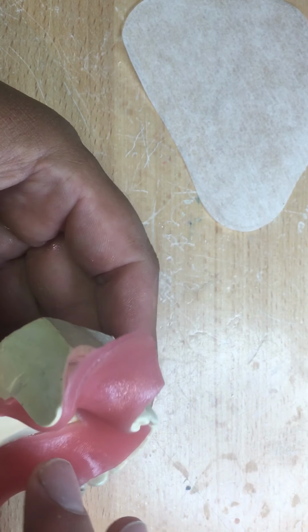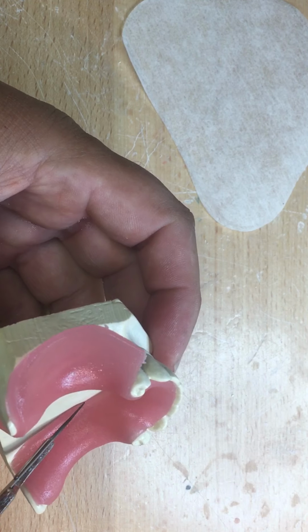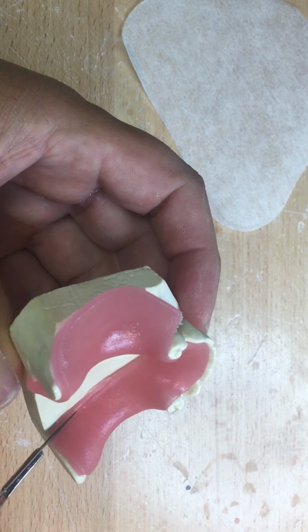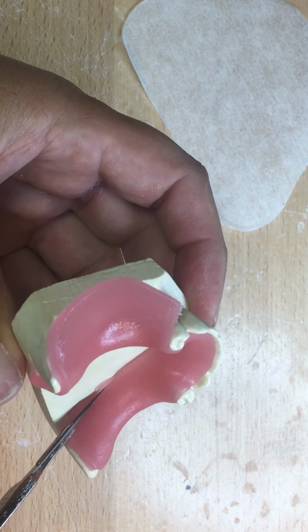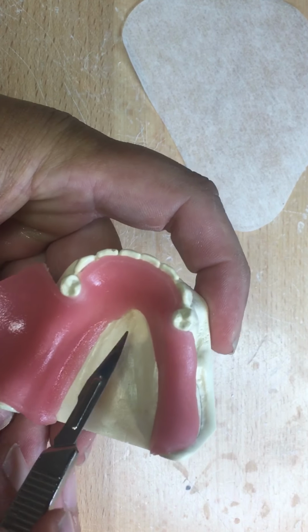And with that measurement comes information to me. I'm choosing tooth size. I'm creating the free end side of my saddle in my framework. I'm creating rest preparation height, width, and depth. So all that information I need.